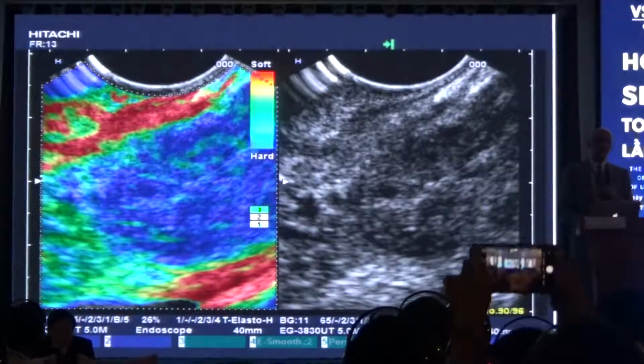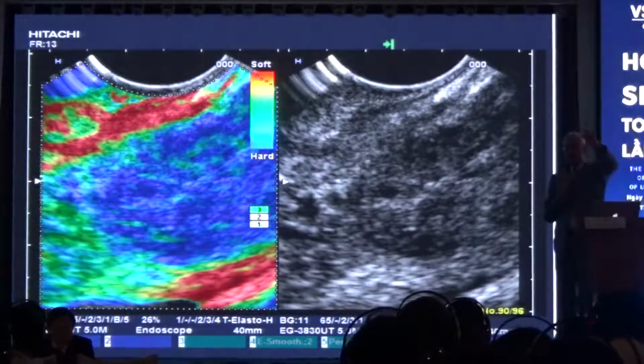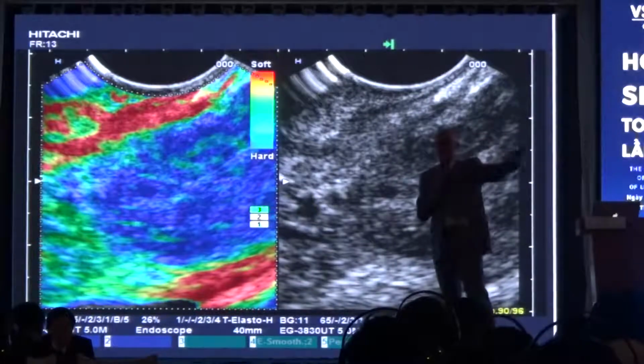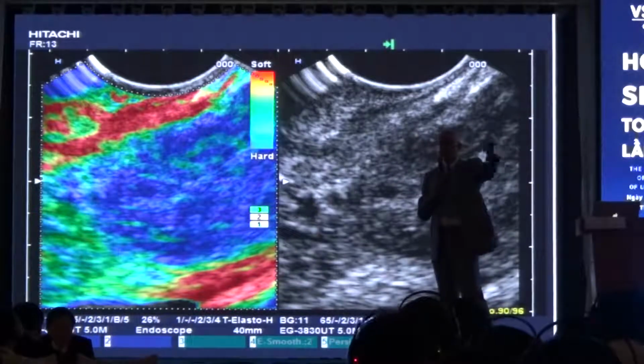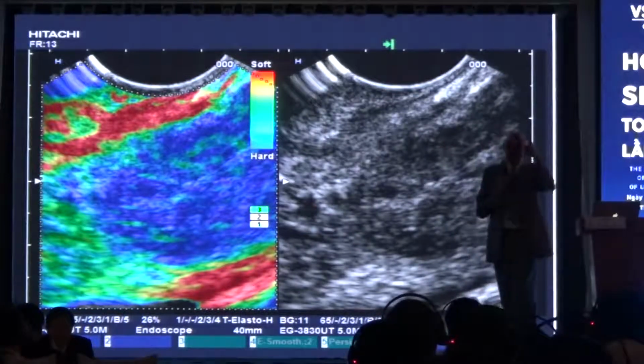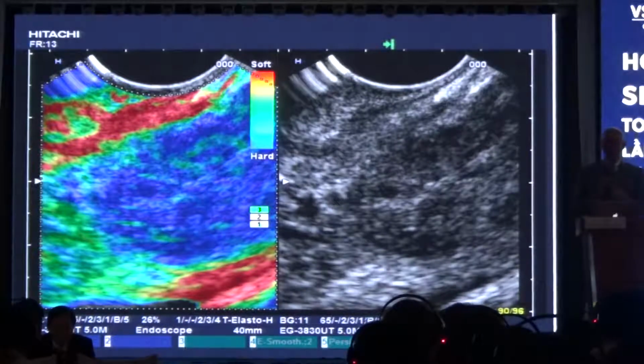So, in autoimmune pancreatitis, a focal lesion is not only stiff, but the other parts of the pancreatic parenchyma are as stiff as well. Even B mode does not show changes. So, elastography adds additional information in patients with autoimmune pancreatitis and is a little less obvious in pancreatic tuberculosis.